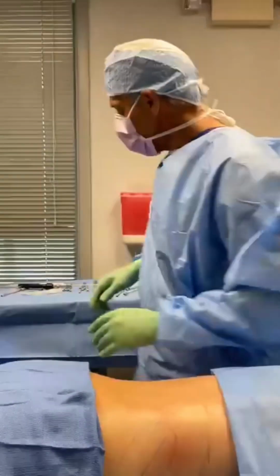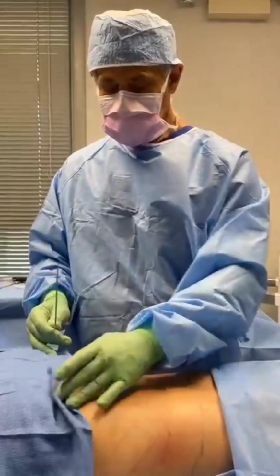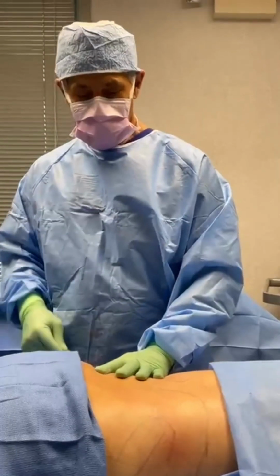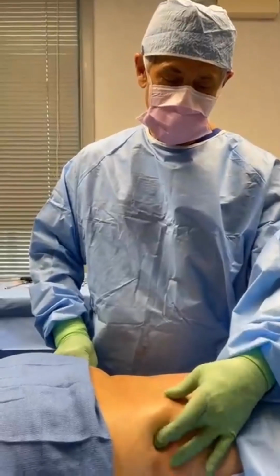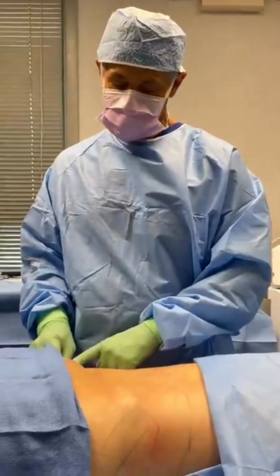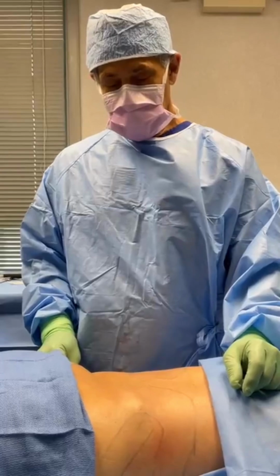So interestingly enough, in sculpting these little areas, and we have so many different choices of cannulas that I can use, but I can be working here and from this side here. So I'm putting this in a little poke hole here, little entryway that I've made, and I'm all the way over here, and I'll poke that so you can see it out a little bit like that. This is the smart hand. That's where I'm actually working. This is just an entry place. But you can see from entering over here, we're able to put that all the way over there for our patient. You didn't feel that at all, yeah? No, I'm completely comfortable. Okay.